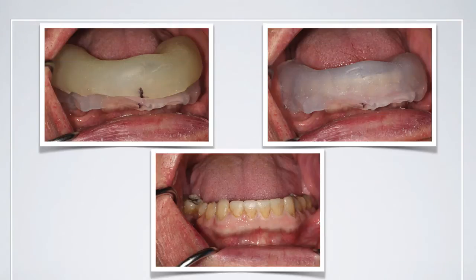In Elwyn's case, we decided to place the six lower anterior teeth in one fell swoop. One of the most common questions is how do you stop the teeth sticking together — there are numerous ways. One is to create a full-arch wax-up, make an impression, remove every other tooth, and first place every other tooth, then come in with the final impression. In Elwyn's case, the teeth were etched and bonded, then the impression tray with PVS material was placed with the warmed composite over the teeth and light cured through the tray. Once we had an initial cure, we removed the acrylic tray and cured directly through the material. Just a few minutes later, we had all six restorations in exactly the place specified by our wax-up.